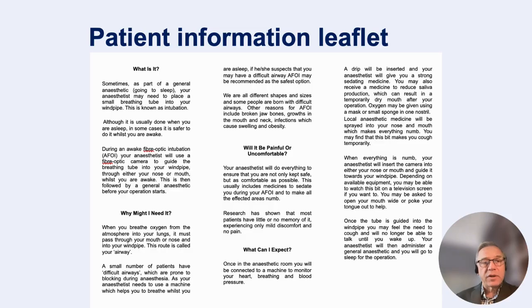And this leaflet includes questions like: what is awake fibre optic intubation? Why might I need it? Will it be painful or uncomfortable? What can I expect?